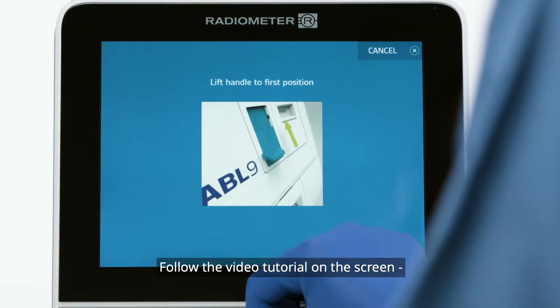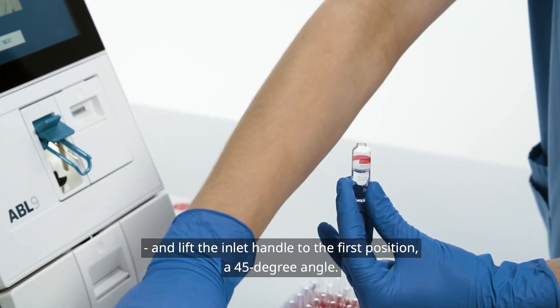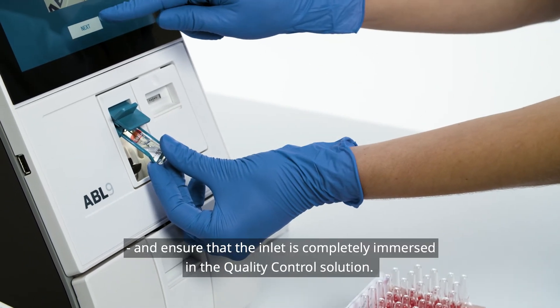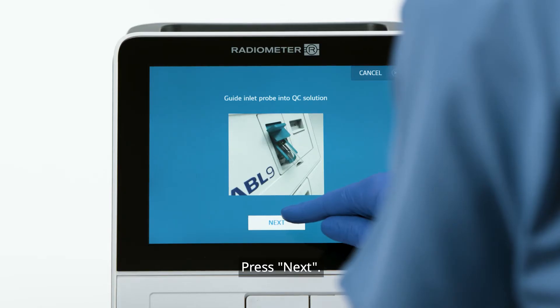Follow the video tutorial on the screen and lift the inlet handle to the first position, a 45-degree angle. Position the quality control ampoule over the inlet probe and ensure that the inlet is completely immersed in the quality control solution. Press Next.